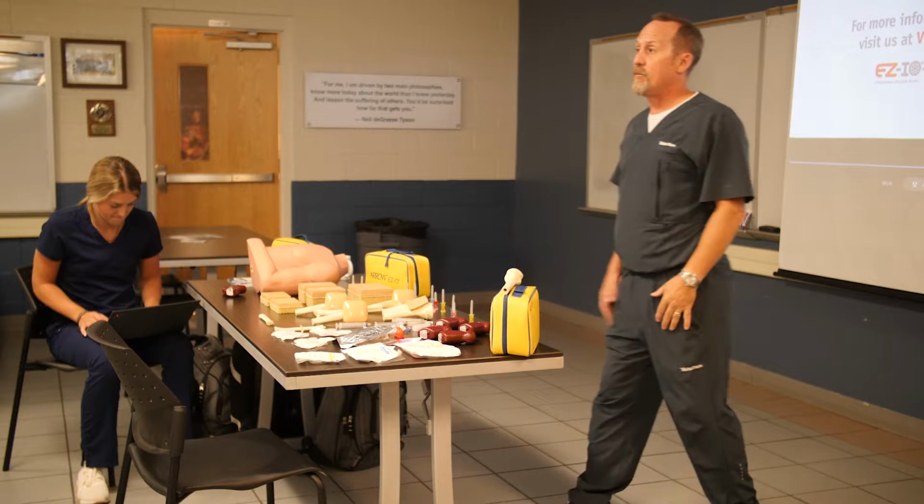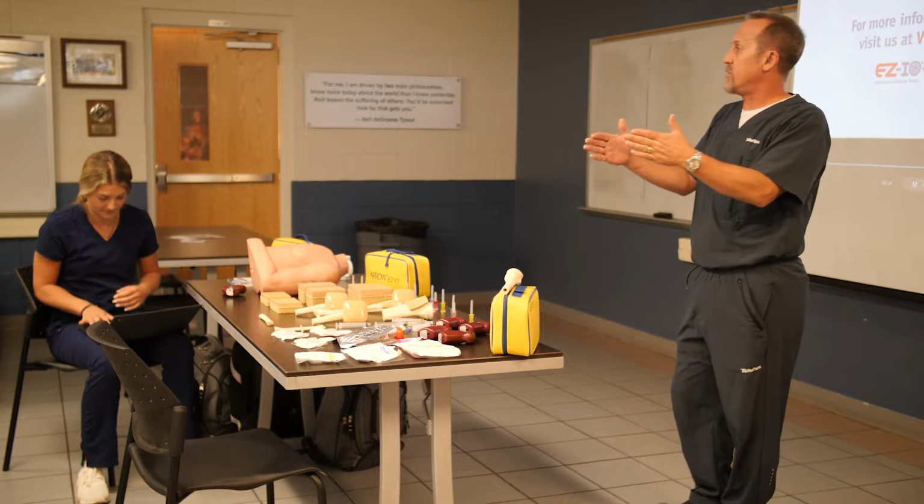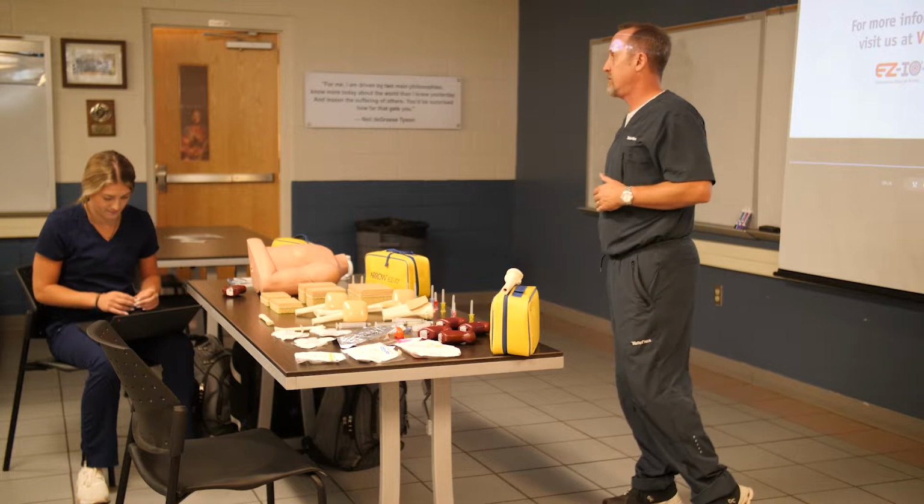So really important to remember, especially with the Lucas, I think the arms go right about here. They're still well below my shoulder. It's going to be an okay position. Just make sure it's positioned properly before you insert the needle. Any questions on that?